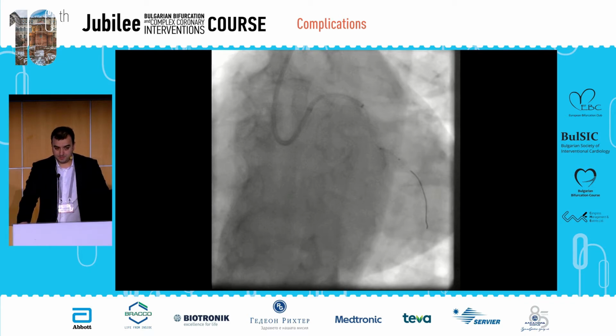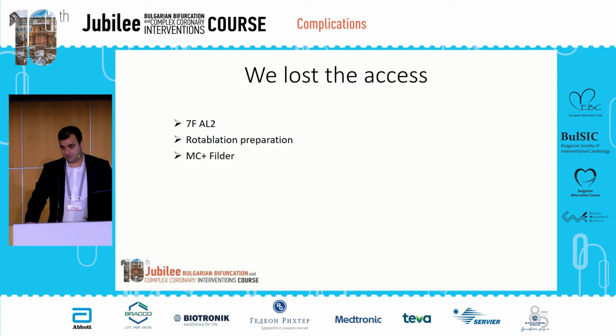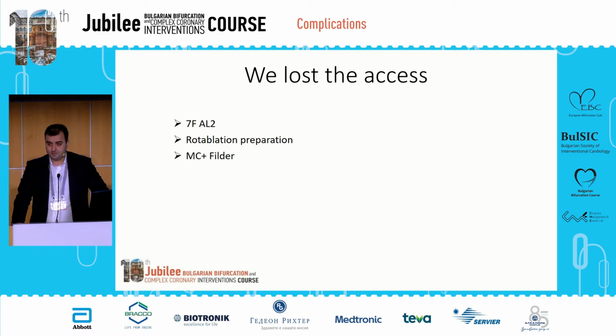After that, we were 2 operators. The other operator took over, and we lost the access. I said, okay, if we want to proceed, we should probably go with 7 French to increase the support with Amplatz and prepare everything for rotablation, microcatheter, and so on.